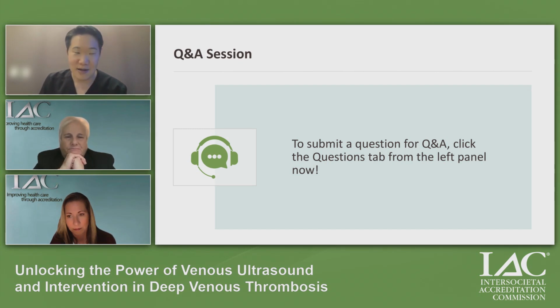In fact, I have to do everything I can, to the point where my biceps hurt sometimes after these procedures, to try and remove some of that clot. So just to give you an idea, most of that chronic thrombus ain't going anywhere, no matter what you do, because I can't even get it out until I really work hard.